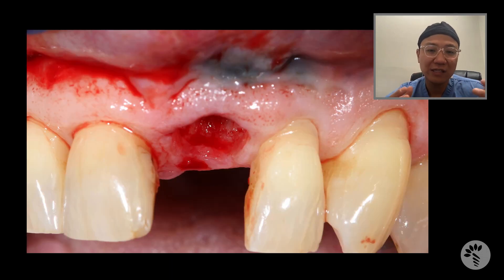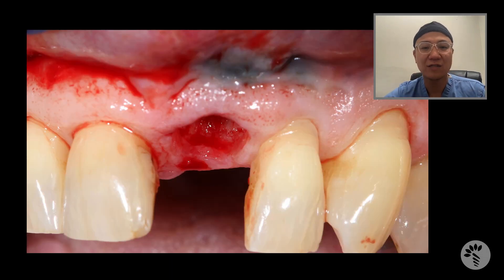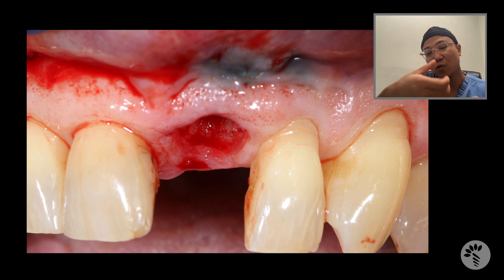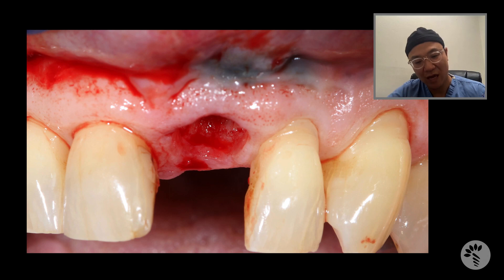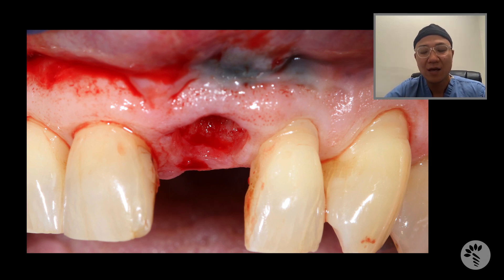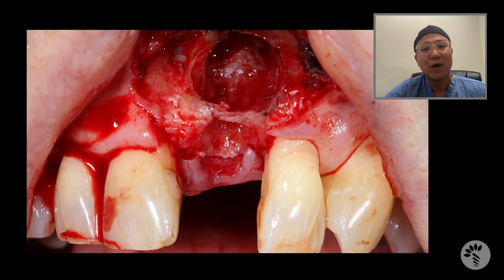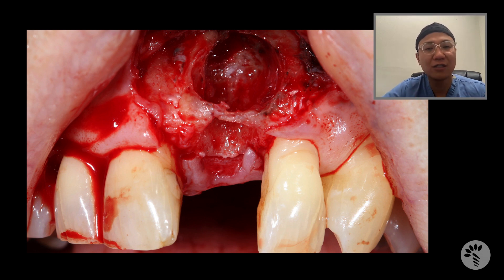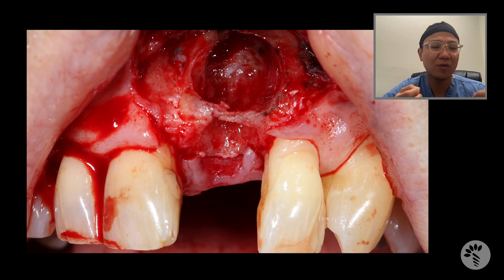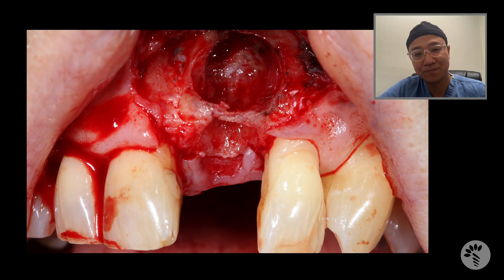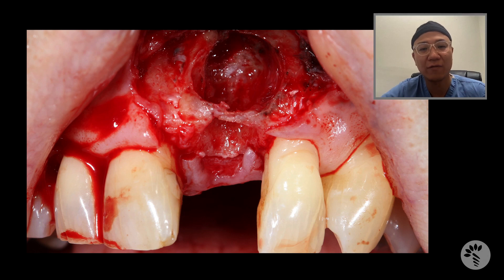The tooth was extracted atraumatically using a periotome and 150 forceps with just a rotational force, and the tooth came out atraumatically. After that, when I raised the flap, you can clearly see there is a large bony concavity or bone cavity. If you think you could remove all this granulation tissue without raising a flap, you're making a big mistake.